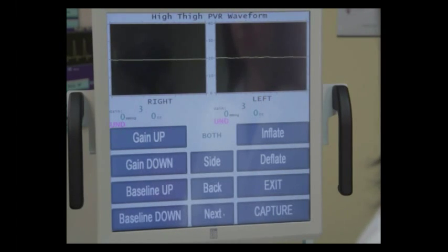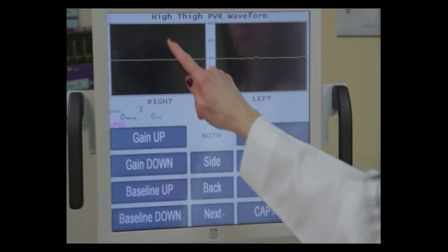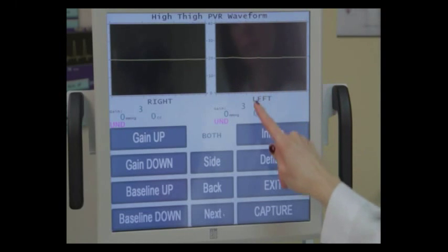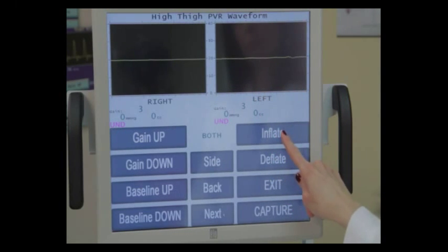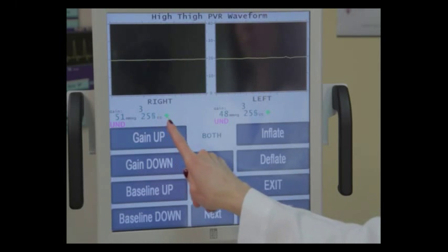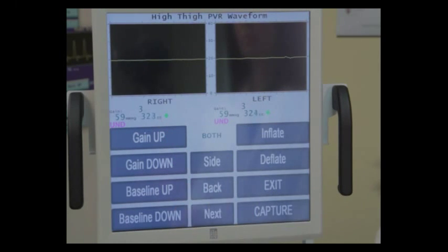The screen is now prompting us to obtain a PVR waveform at the high thigh level. Again, we're going to simply press the inflate button once, and we're going to look at our pressures, our indicator diamond lights, and our volume lights. If all is good, we're going to let 3 consecutive waveforms settle in, and we'll capture those.